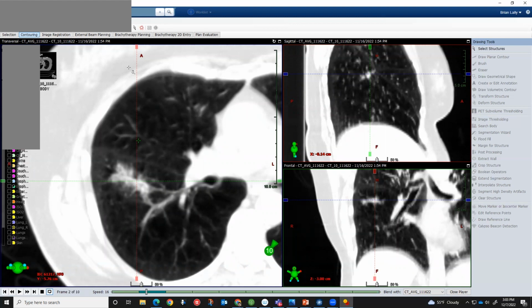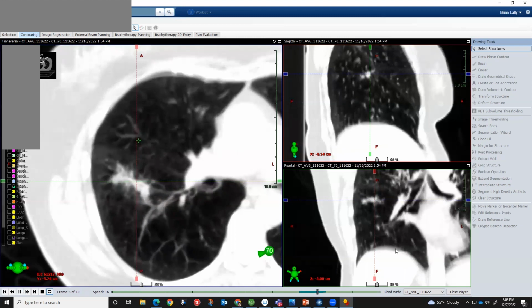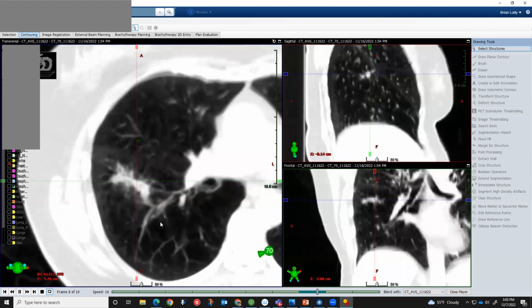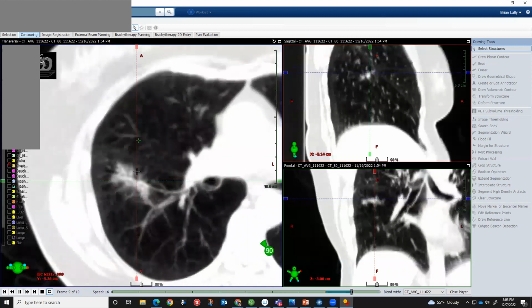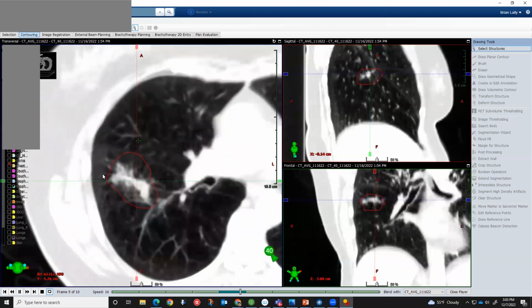One of the important things that we have to do when we're treating with stereotactic body radiotherapy is to account for respiration. As patients breathe, things in their lungs tend to move. And so we have to make sure we follow them and account for that respiration. As you can see here, this patient is breathing and the diaphragm is moving a fair amount. There tends to be a lot of motion at the lung base, but very little near the apex. And so what we do is we contour out this area that we want to be able to cover. And there you see a contour.